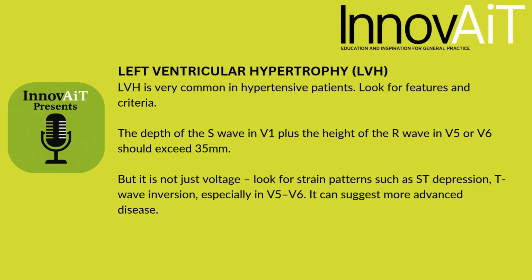But it's not just voltage. Look for strain patterns, such as ST depression, T wave inversion, especially in the lateral leads. It can suggest more advanced disease.